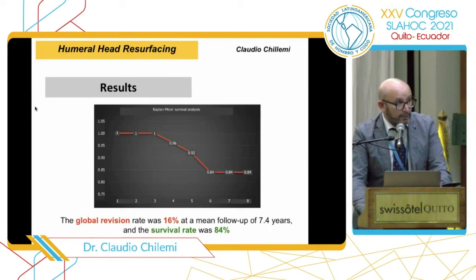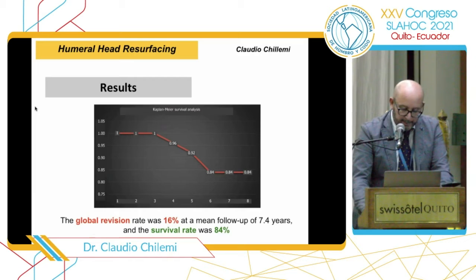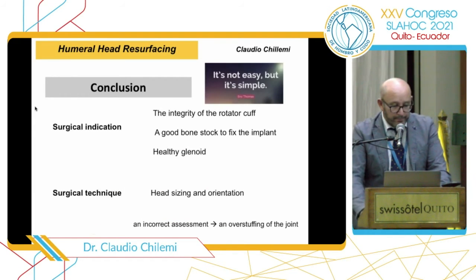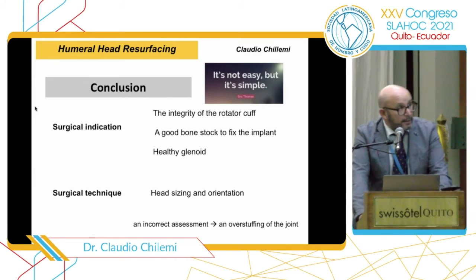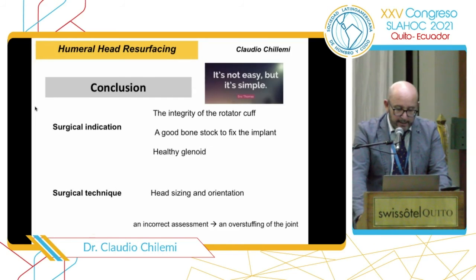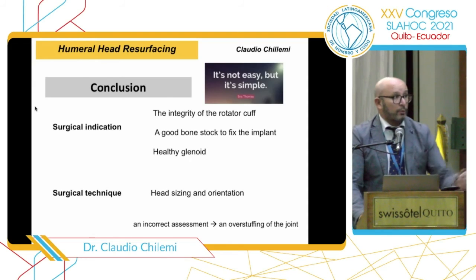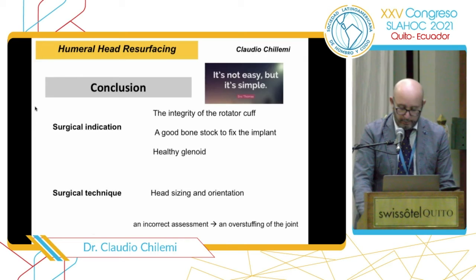The global revision rate was 16% at a mean follow-up of 7.4 years, while the survival rate was 84%. So in conclusion, this type of prosthesis is not easy. It requires a really precise surgical indication, because we have to evaluate the integrity of the cuff, good bone stock to fix the implant, and a healthy glenoid. The surgical technique is really precise, in particular when you have to size the head and orient it, because an incorrect assessment may produce an overstuffing of the joint, and so may produce the failure of the implant.